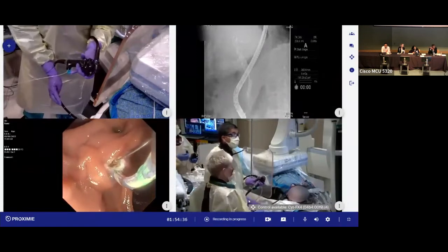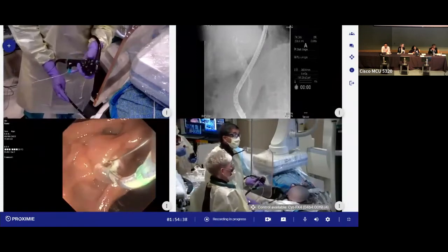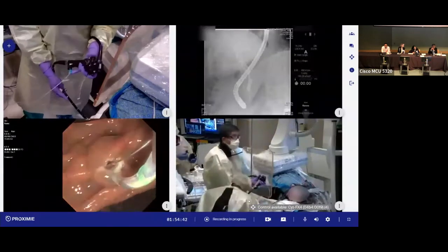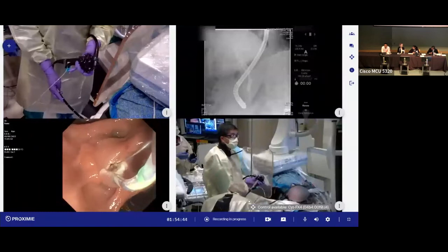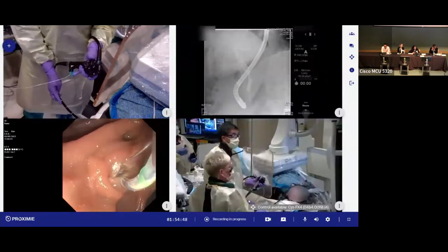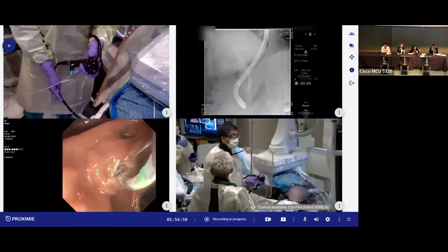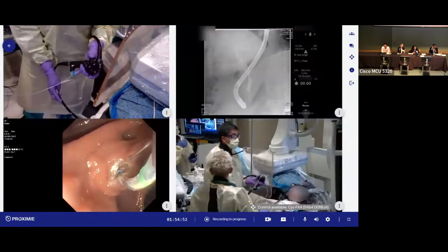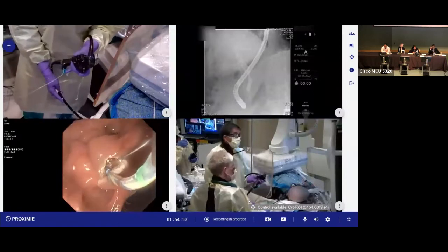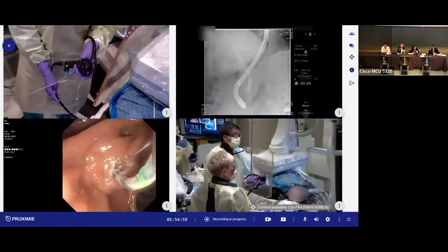Well, what would the panel do with respect to the strategy here for stone removal? Yeah, I think we don't need that big a sphincterotomy. We'll be all right. Large papillary dilation, especially to facilitate multiple stones, then just a partial sphincterotomy, and then just divide and conquer with the extraction balloon starting distally.